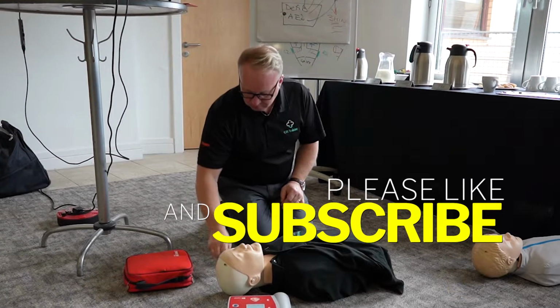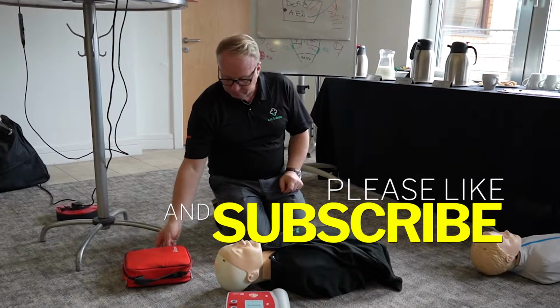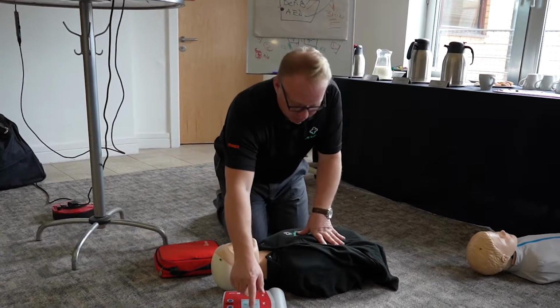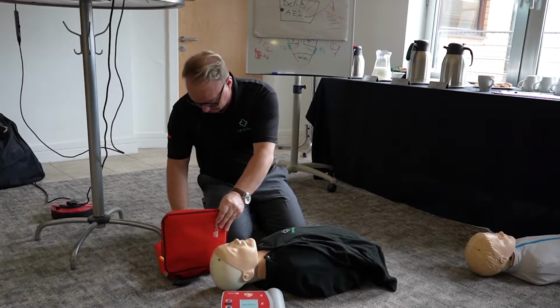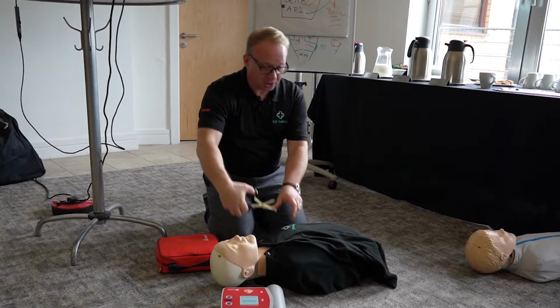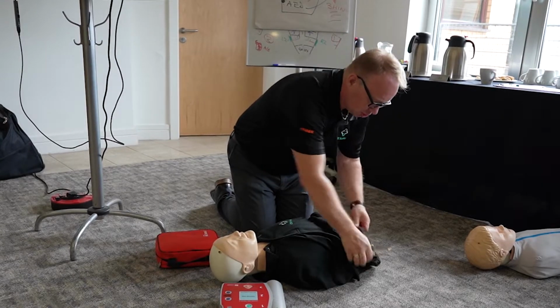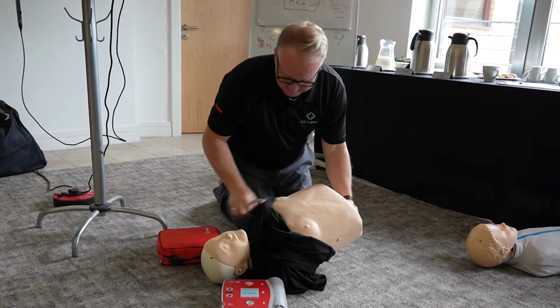Apply pads to patient's bare chest. Plug in pads connector next to flashing light. Bare chest. So do I have to strip them? I do. Have you got scissors? You have. Can you do that? Of course you can. Strip the clothing off, quick as you can.